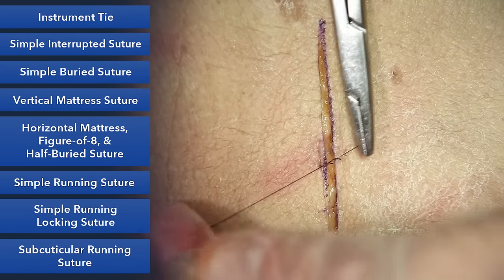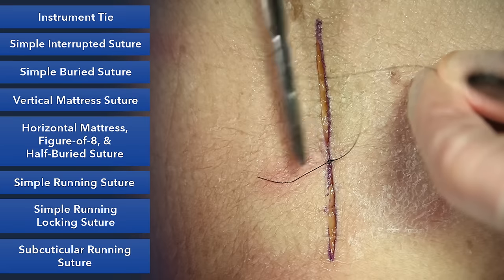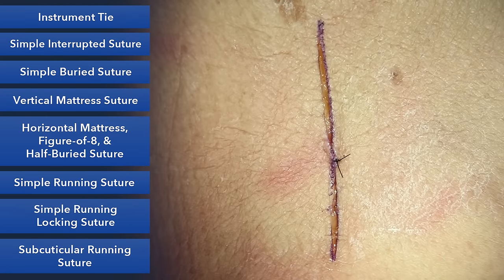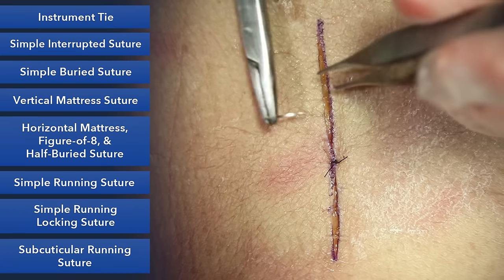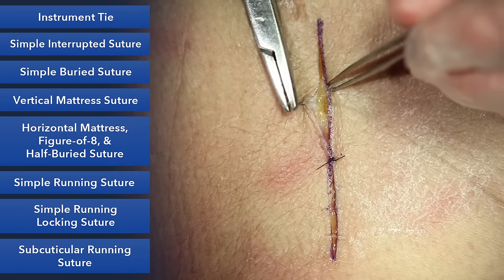Here we'll set up an instrument tie. And you can see here again, we do 3 throws for nylon. And we'll go ahead and clip this. This is approximation without tension. You want to go back a couple millimeters for each bite. If you go back too far, it'll tend to invert the skin, and we want to avoid that.